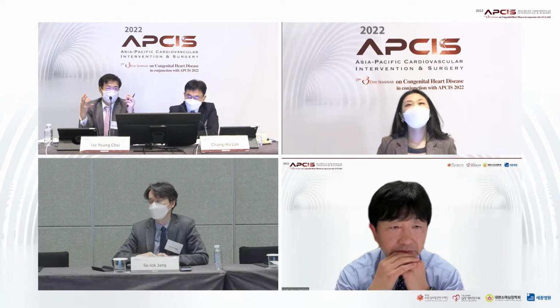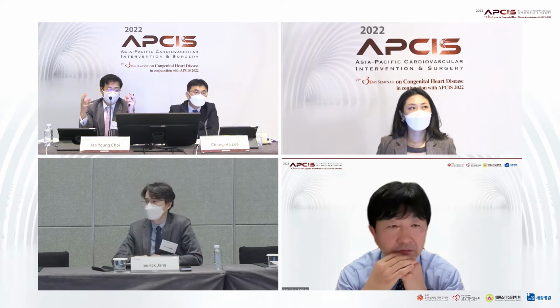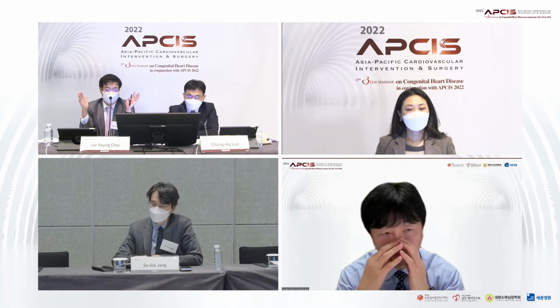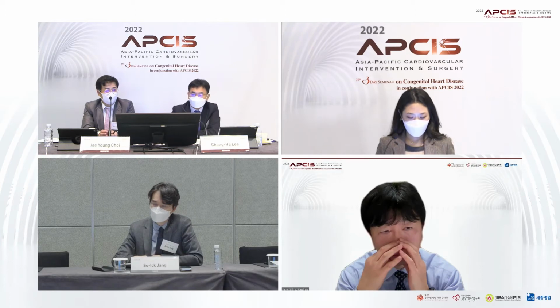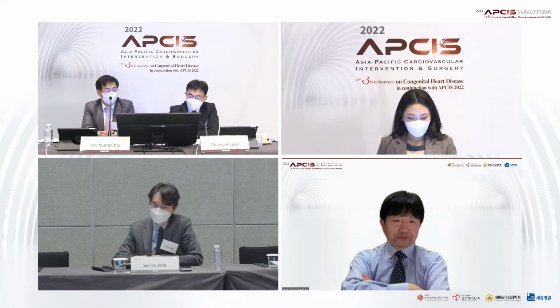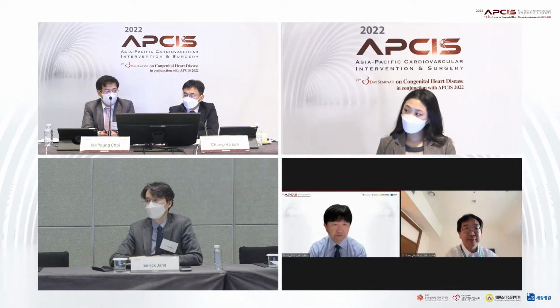If you rapidly inflate the balloon, inflation of the balloon at both sides may compress the balloon length and shorten the stent length, which frequently decreases the pressure gradient because the narrow portion is shorter, even though it couldn't be dilated further. So we can remodel the stent. That is one of the important features.